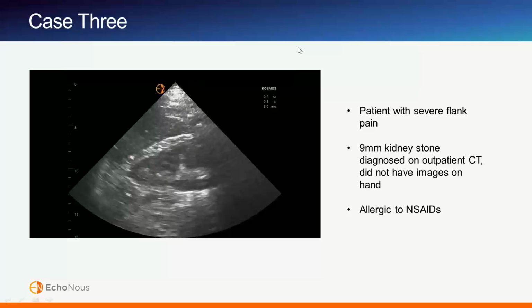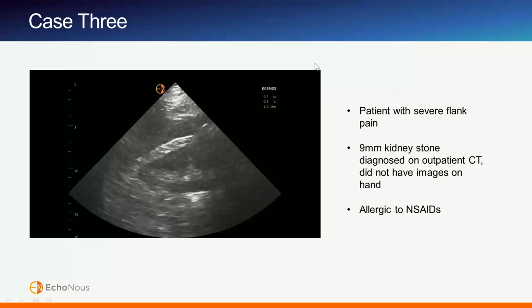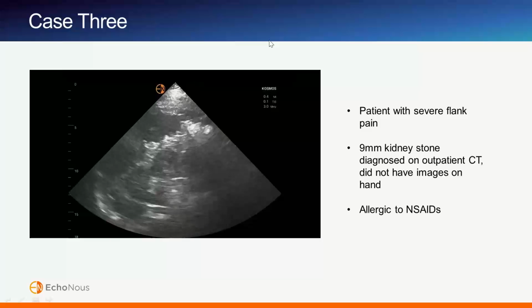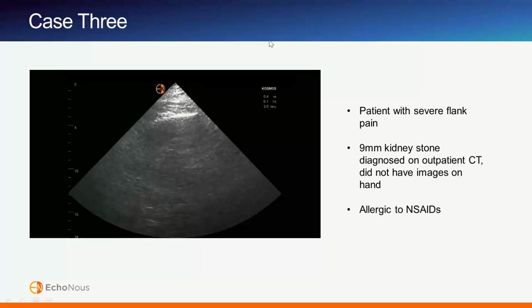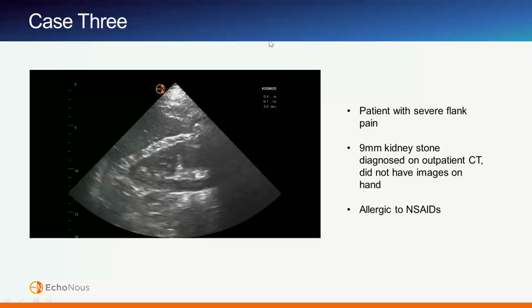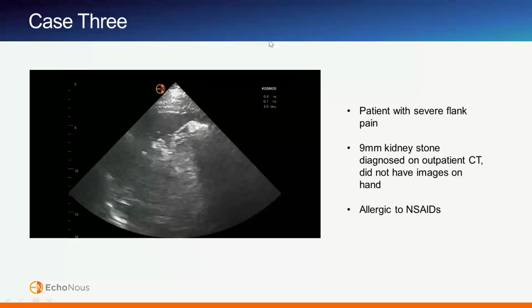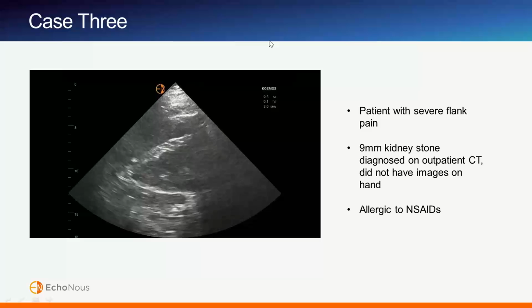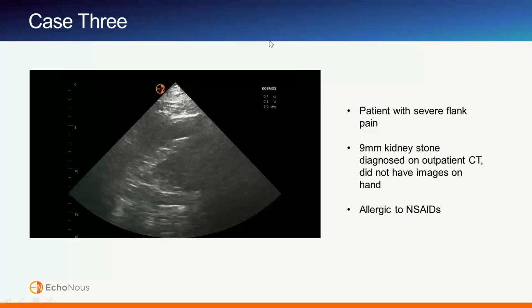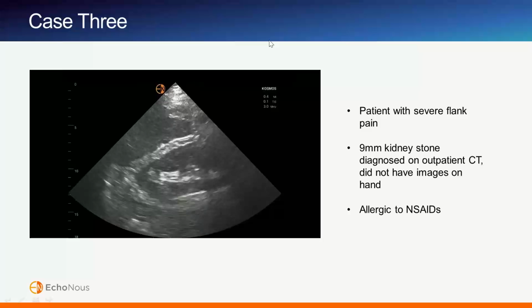You can try calling the source and seeing if you can get images over the phone, just the read, or for them to courier them to your location, depending on where it is. There are all sorts of complications when it comes to us not being able to see outside images. For kidney stone, this is very common. I feel like I've seen this case often. And yes, it sounds like there's some theme of potential suspicion about the patient's intentions.